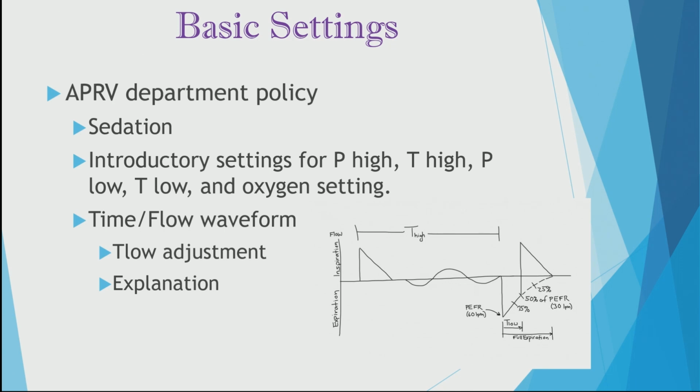However, I want to make it abundantly clear that these settings are in no way a substitute for the good eye, for the clinical knowledge of a bedside respiratory therapist. With that said, please monitor and observe your patients closely.